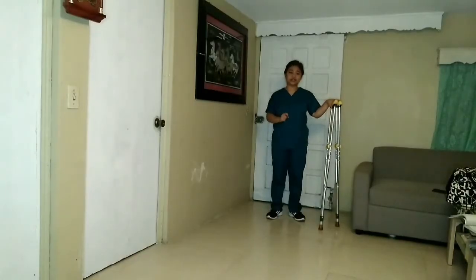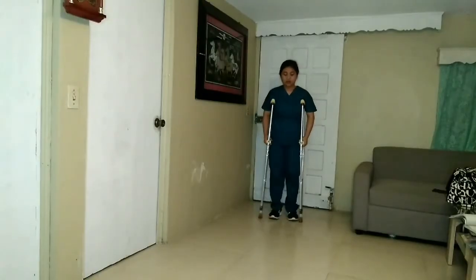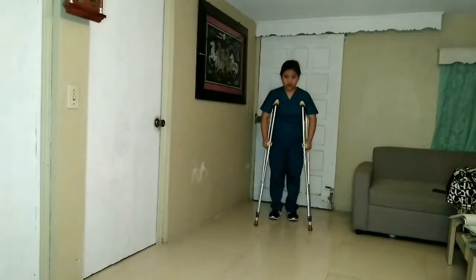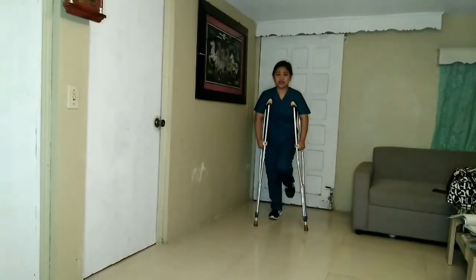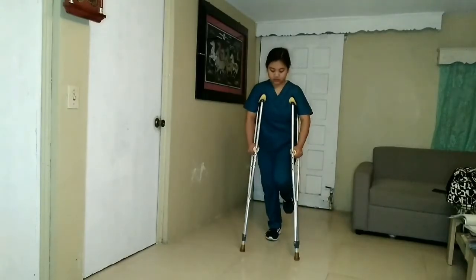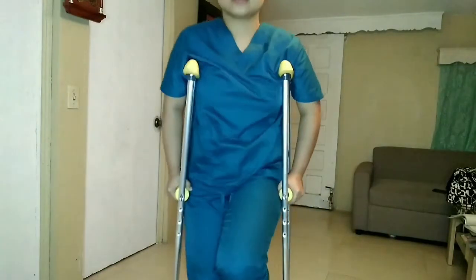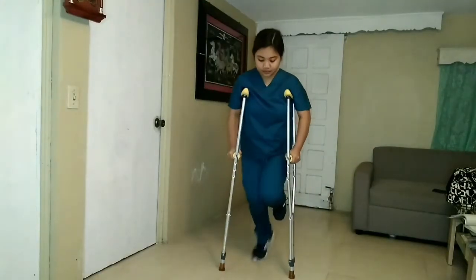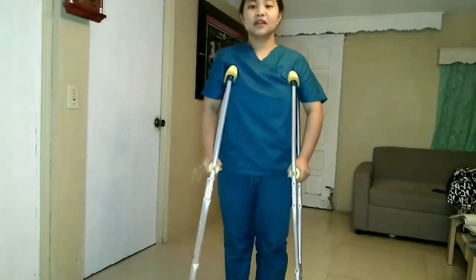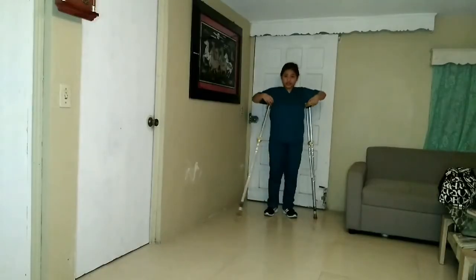Secondly, instruct our patient to use the 3-point gait. Begin with tripod position. Advance both crutches with the affected leg. Move the strong leg forward, stepping on the foot. Repeat the sequence.